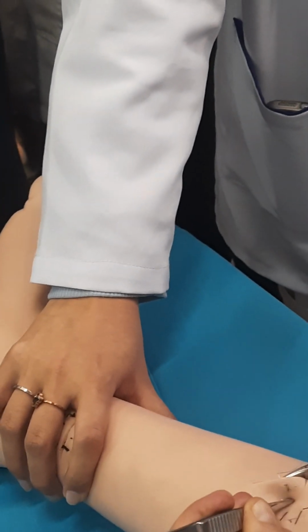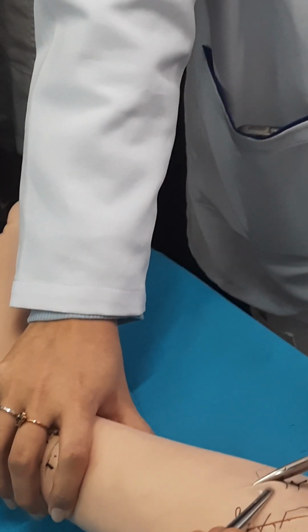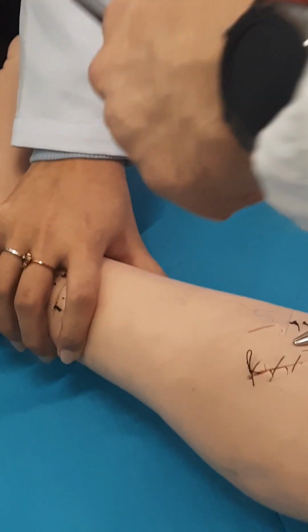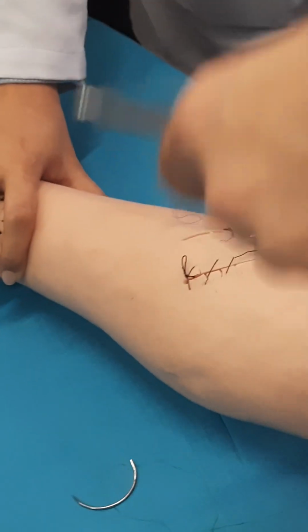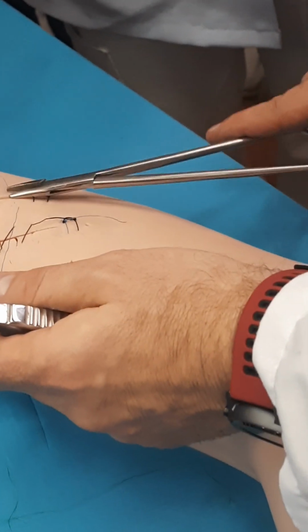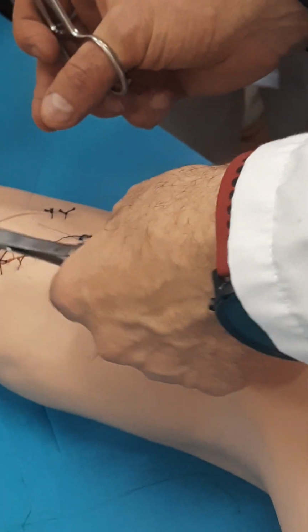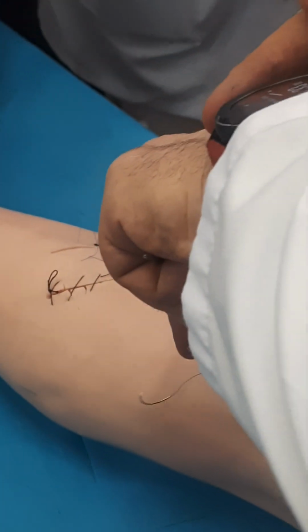My needle is just very short. You now make fixation of the tip. You open your instrument, and even with this instrument you can remove it. Now, if you look, you will see that we have absolutely equal piercing distances. And I must start to make the knotting. By the way, I will show you last time. Nowadays, I don't think that my time will be enough.